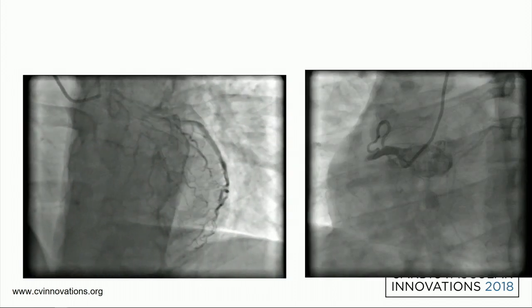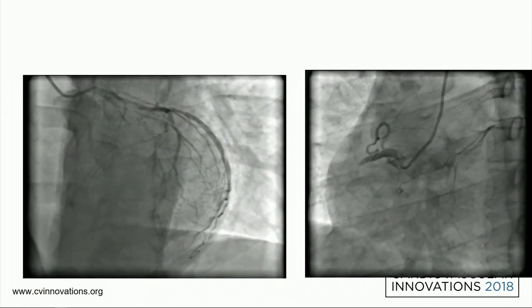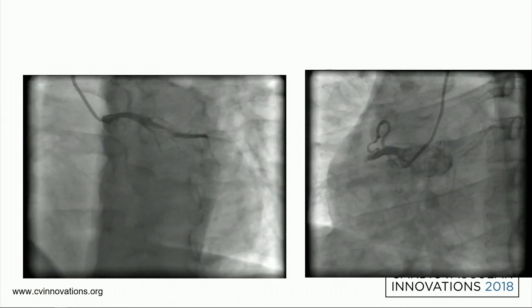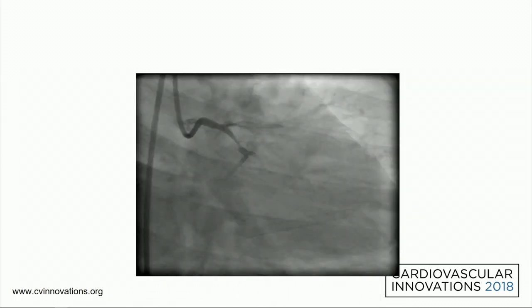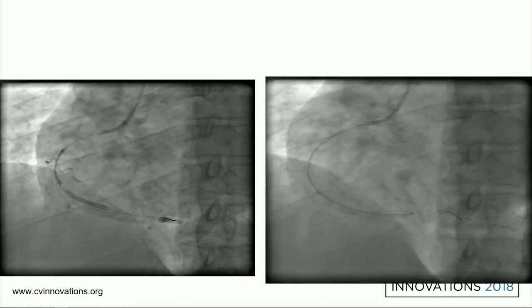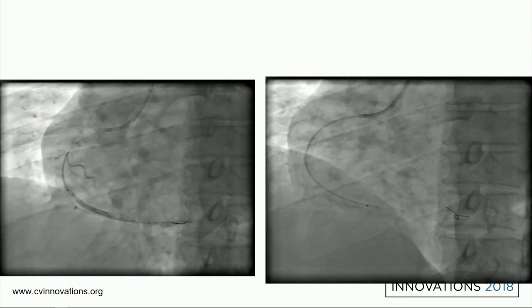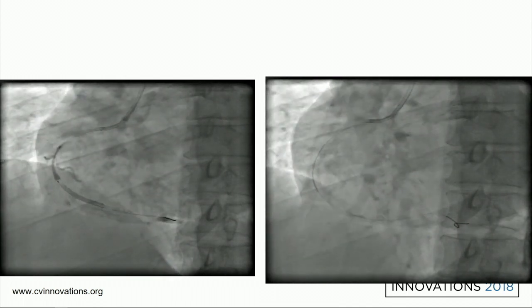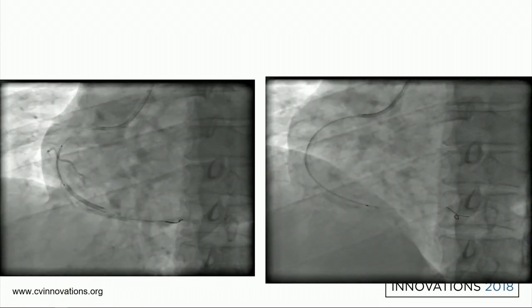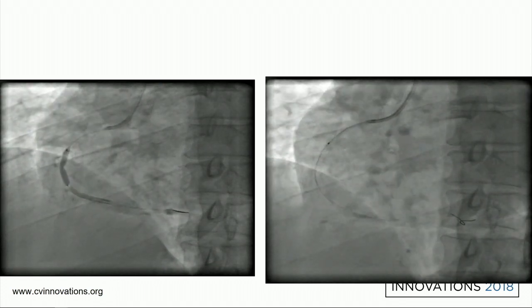You can see from this angiogram, this radial route, it shows a CTO of the LAD, some disease in the circ, and the RCA, which is occluded. Since it was an inferior wall STEMI, we thought we'd tackle the right coronary artery first. Through the radial route, we used a 6 French Judkins Right, and then we pre-dilated the mid-RCA lesion, and then we deployed the stent.